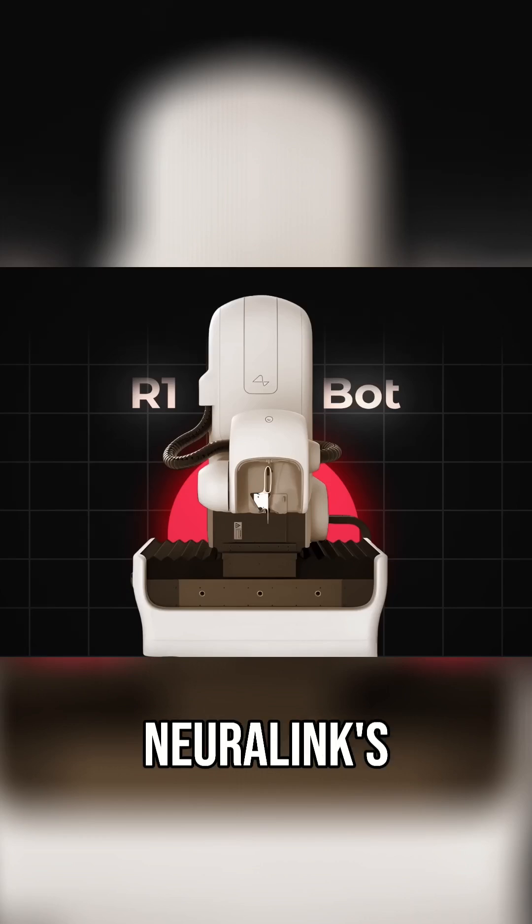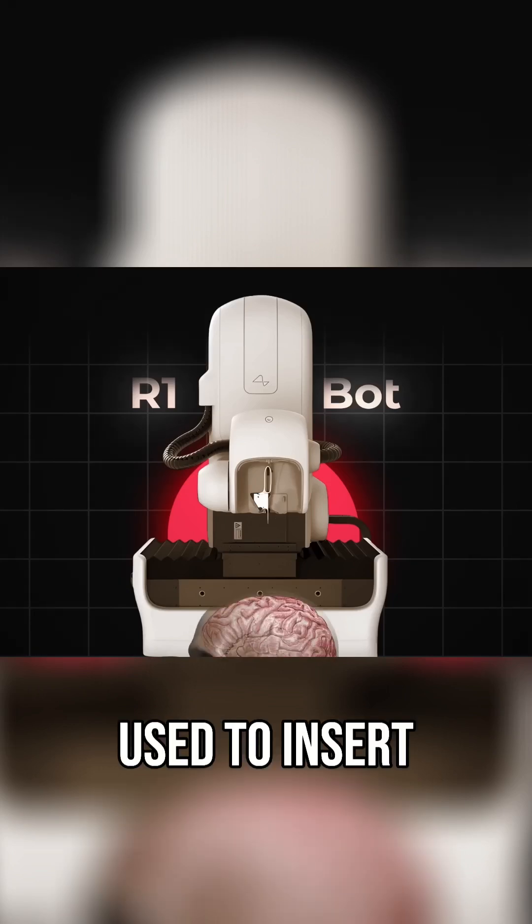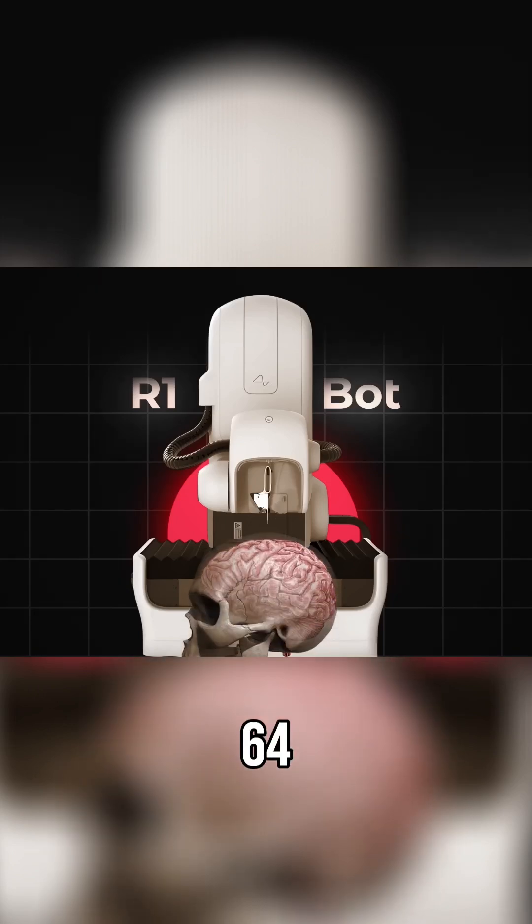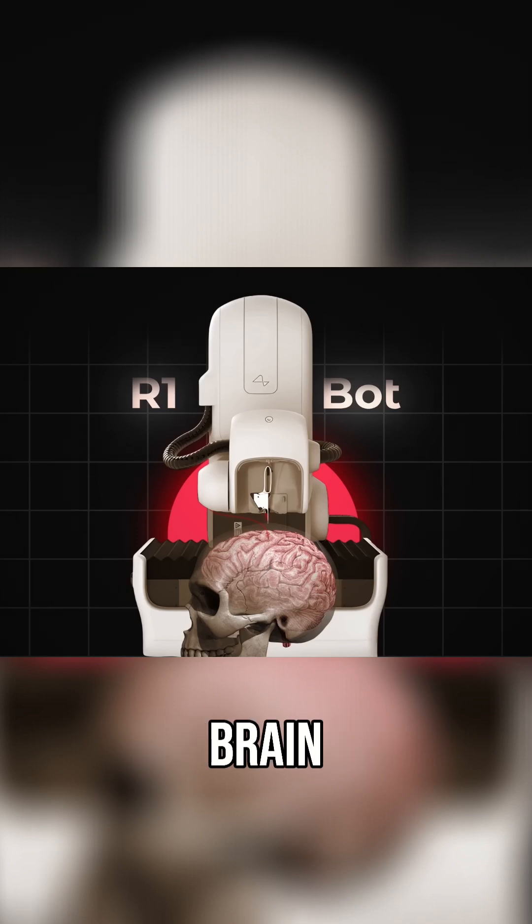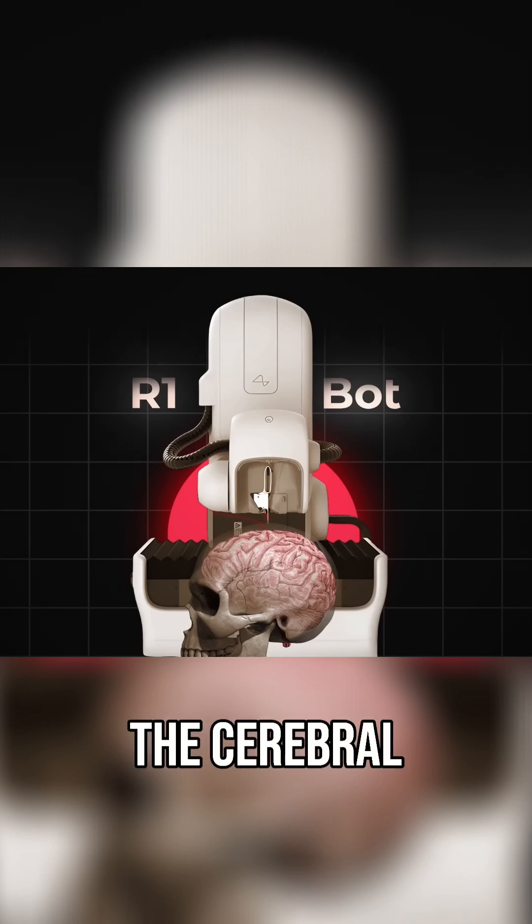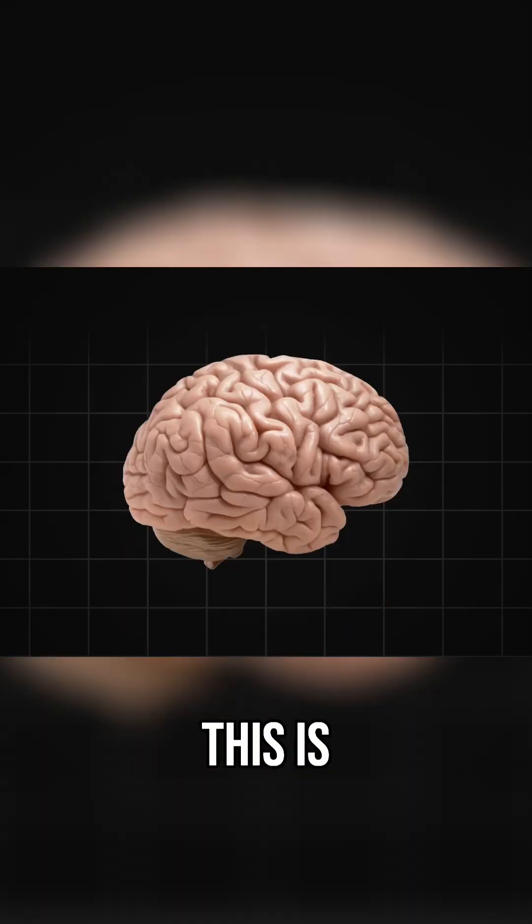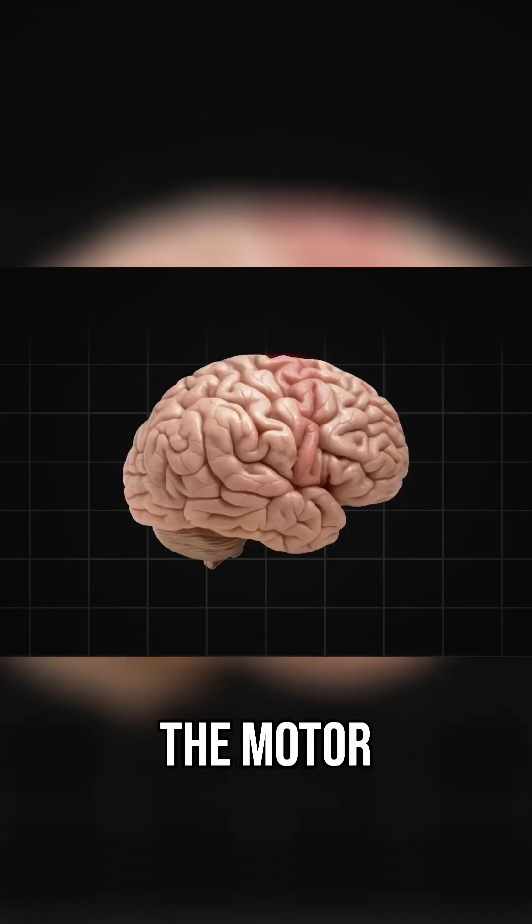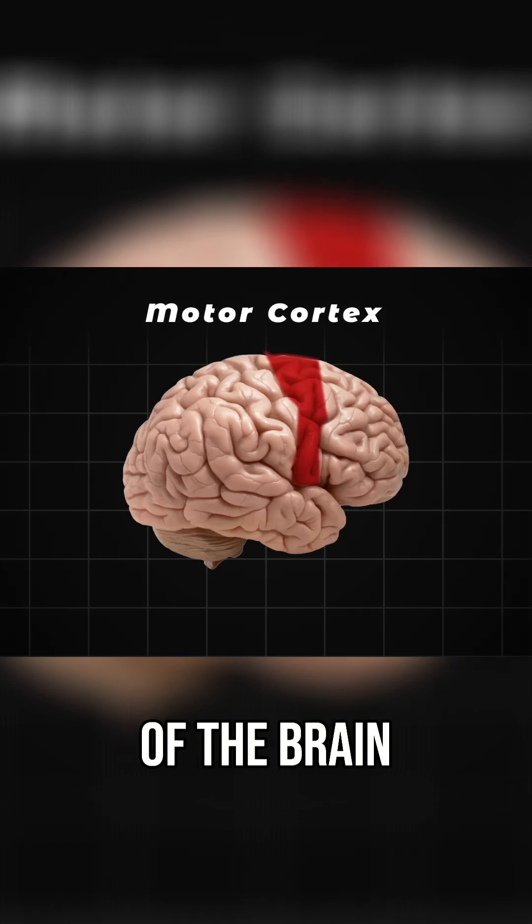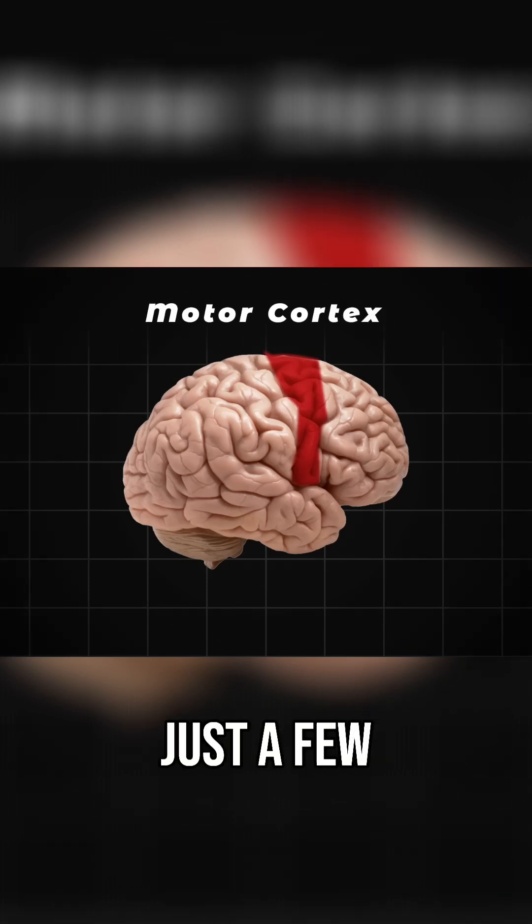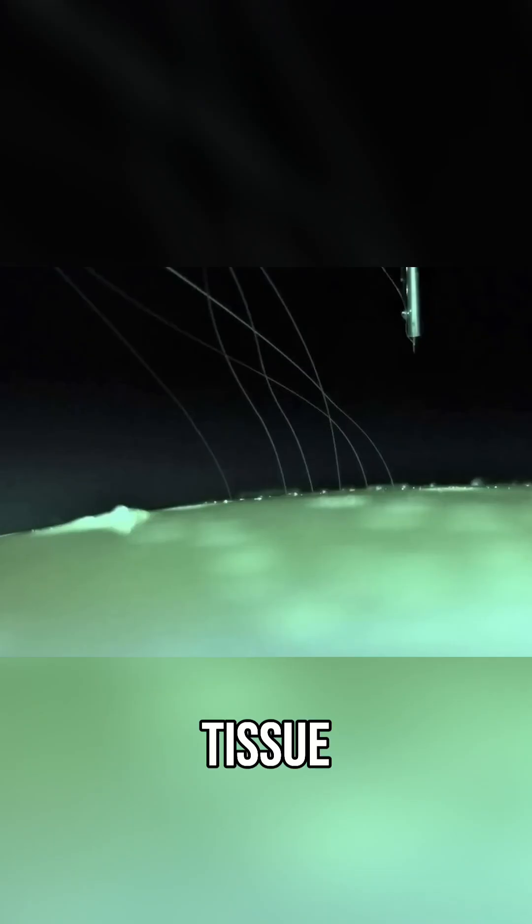During the surgical procedure, Neuralink's R1 robot was used to insert 64 threads into the outer layer of the brain, the cerebral cortex, and specifically, this is targeted into the motor cortex region of the brain, penetrating just a few millimeters deep into the tissue.